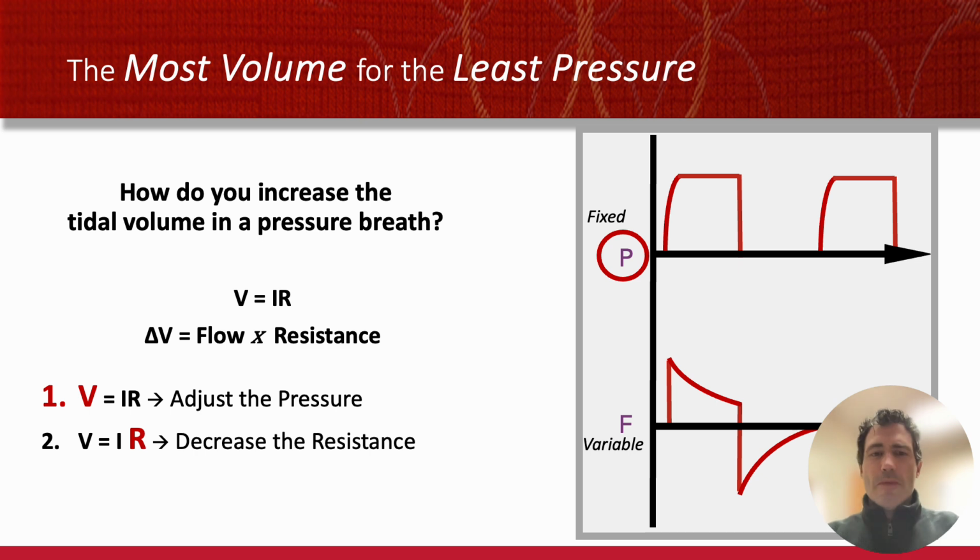It's also important to remember that we can manipulate resistance, and it's not always done by, say, treating pneumonia. We, of course, want to treat pneumonia and the underlying things like ARDS or bronchospasm, but you can do even simpler things to decrease the resistance. Things like if the patient's large and has abdominal weight pushing on their diaphragm, we can sit them up, and now the vent doesn't have to move that weight.